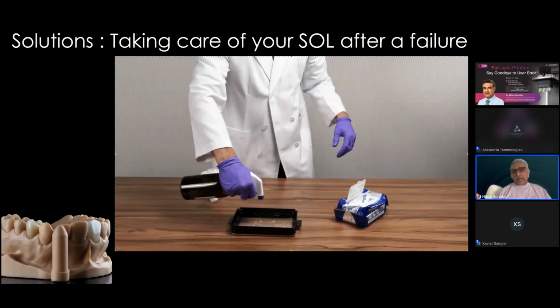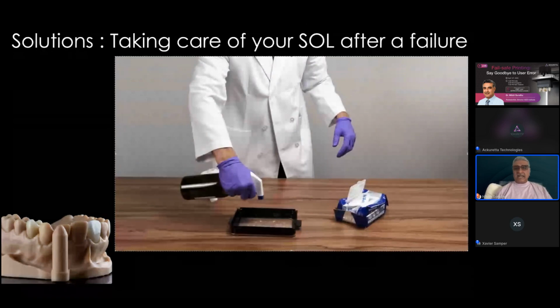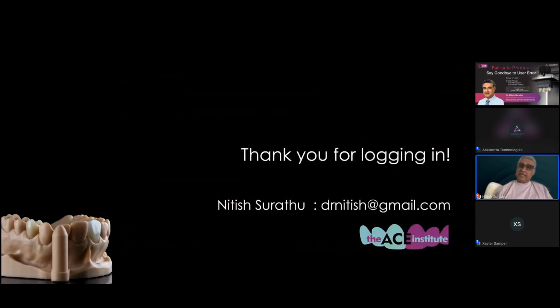So it's not just about having failures and figuring out why those failures occur. I hope I've given you a decent understanding of why those failures occur, but it's also important to take care of your printer after a failure has actually taken place. And that's significantly important as well if you want to make sure that your Z-axis isn't thrown out of gear and if you don't want to create further problems for yourself.